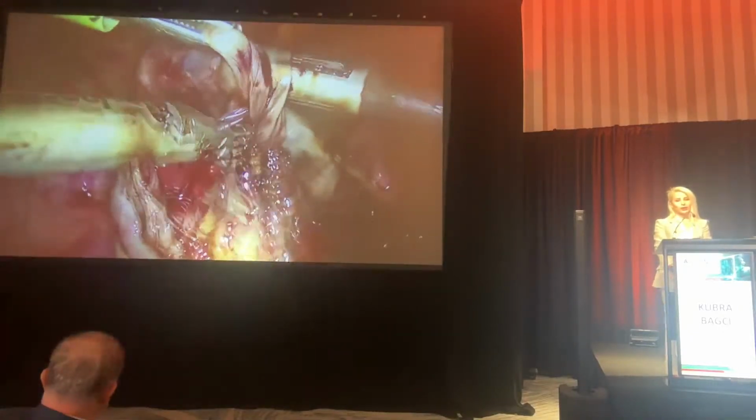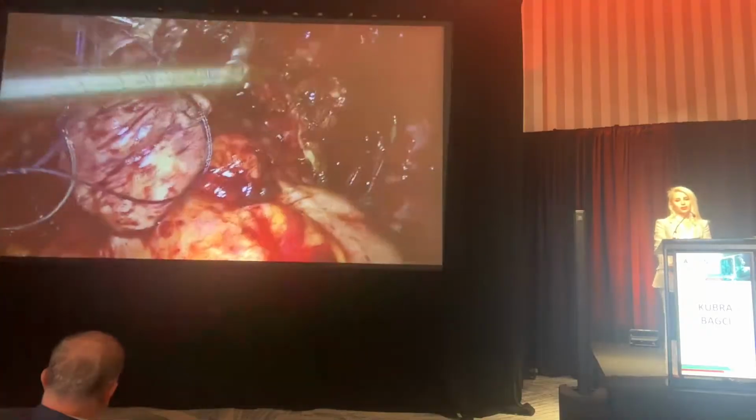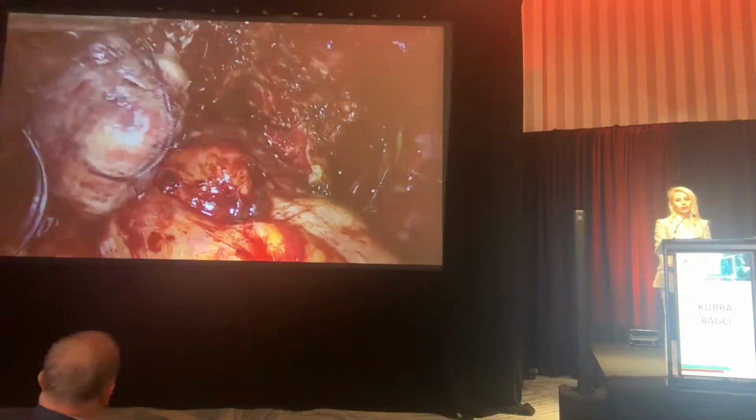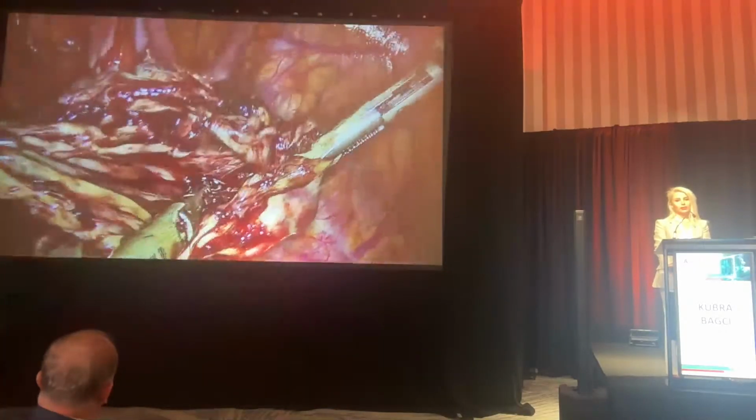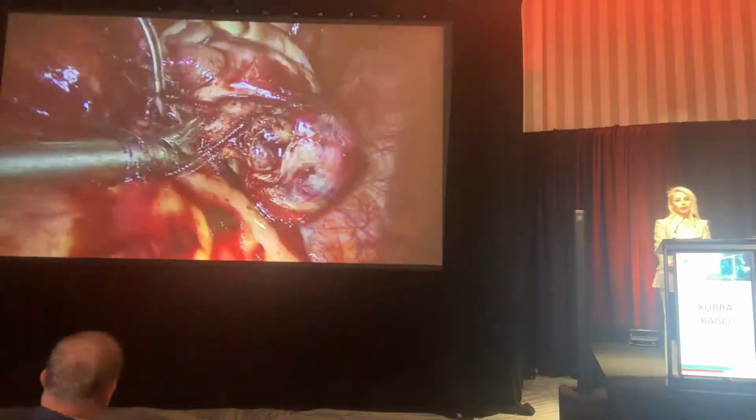Cystectomy of the left ovary was performed, followed by meticulous ovarian reconstruction. Cystectomy of the right ovary was performed, followed by meticulous ovarian reconstruction.